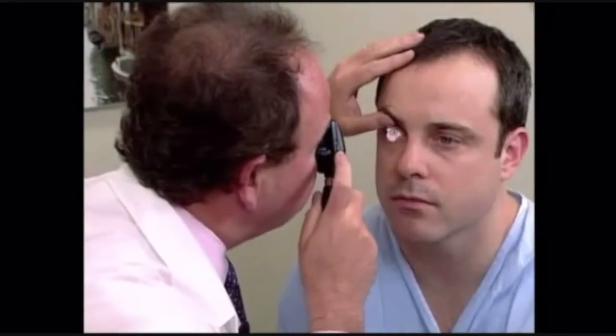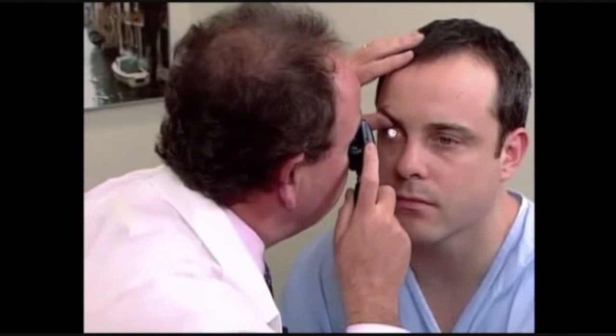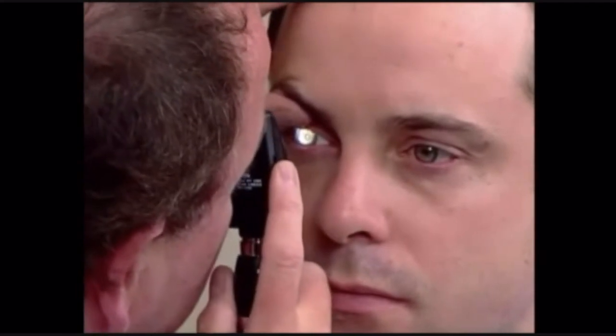As you move closer to the patient, you will turn the lenses to focus deeper as one gets into the eye, past the lens, through the vitreous, and then into the retina. You must always be at eye level with the patient. First visualize superior nasal, inferior temporal, and superior temporal.